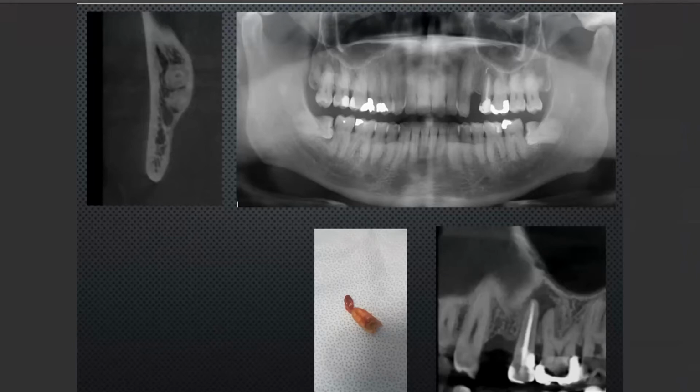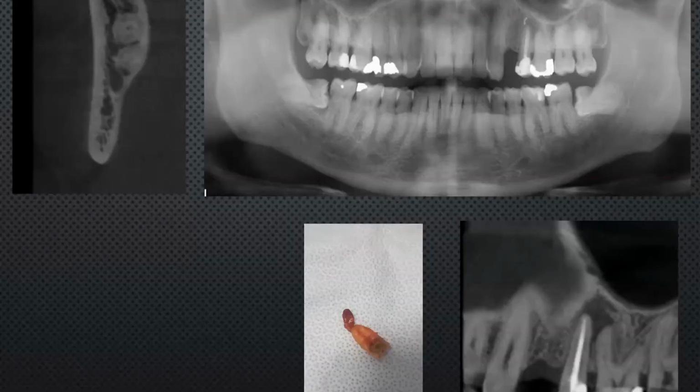So I'm looking at the patient clinically, and I'm looking at the space for restoring the 2-4 implant. Now we've got to remember the OPG is deceptive. It looks like the space is really narrow mesiodistally, but clinically there's plenty of space. As the X-ray beam comes around the head, through the body area, basically in line with the pupils, essentially this area here, the image is squashed, so everything looks much closer together. So actually clinically there's a lot more room for an implant there.